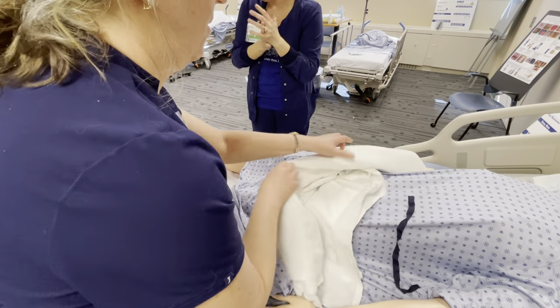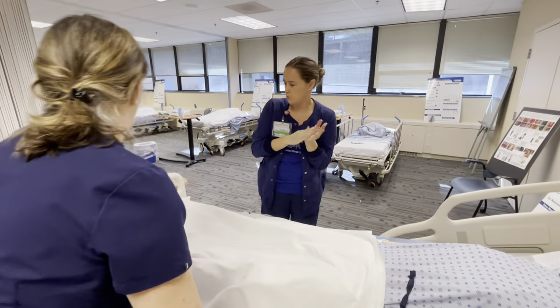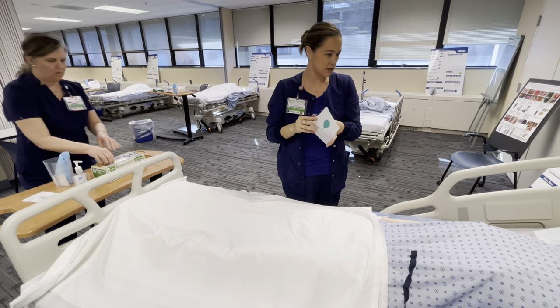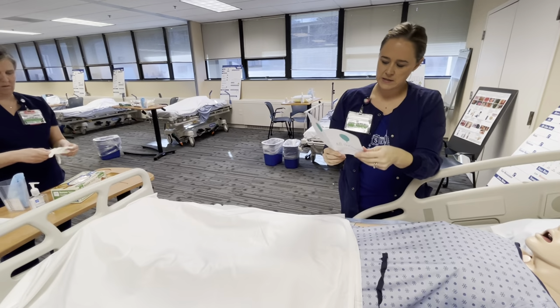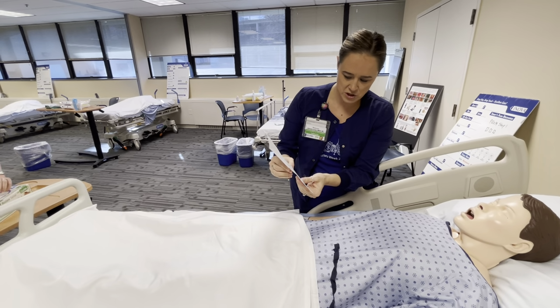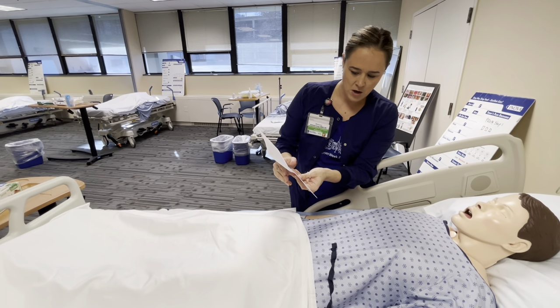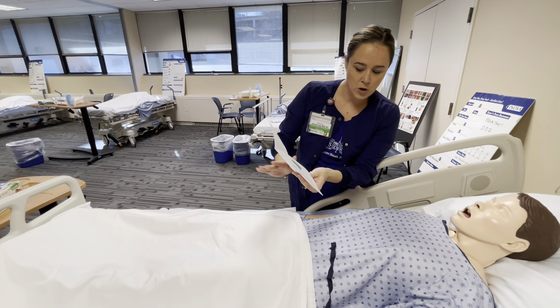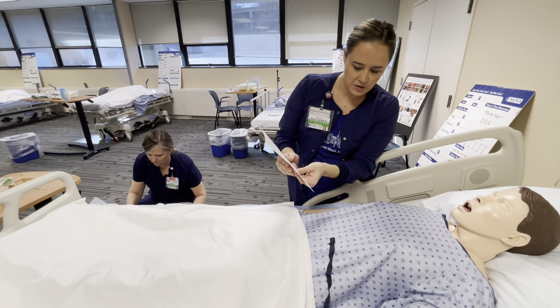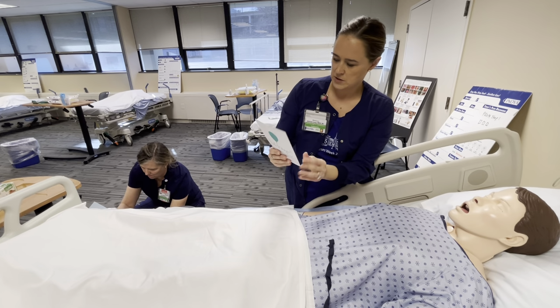I'm gonna go over a few points of education with you while Janine empties the drainage bag of your catheter. We'll also document this in Epic and report back to the nurse how it went. I'm gonna leave this on your bedside table. The most important thing to remember is to wash your hands before and after touching your catheter, making sure the tube is secured to your leg and not twisting or pulling on it. Always keeping the collection bag below the level of your belly button. Don't attempt to disconnect the catheter yourself, and make sure you're asking your doctor every day whether you still need the catheter. Do you understand, sir?